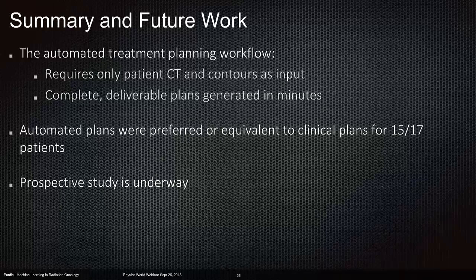Okay, and if a model is trained on generic data, is it still possible to use any patient-specific information in creating the treatment plan? Yes. So I think there are different ways to interpret this question, but one answer here is that the machine learning model will adapt to the new geometry or new patient automatically. I mean, that's in the nature of machine learning. But also we can say here that the treatment plan generated is exactly as any other plan in RayStation, so it can be processed if necessary.